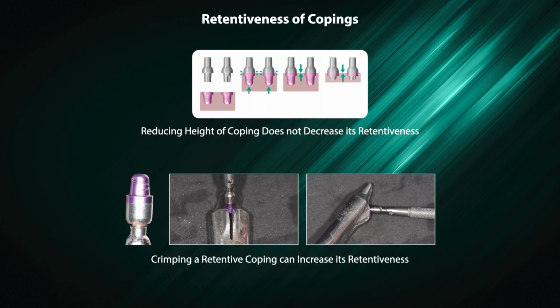Retentiveness of copings. Reducing the height of a coping does not decrease its retentiveness. Crimping a retentive coping can increase its retentiveness.